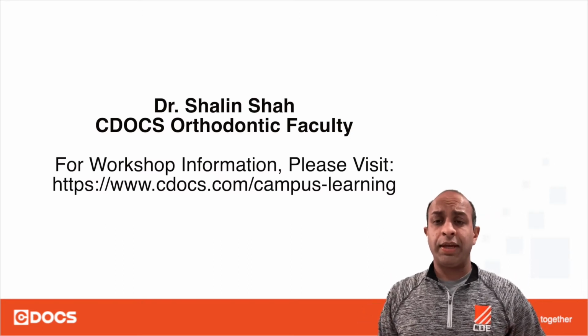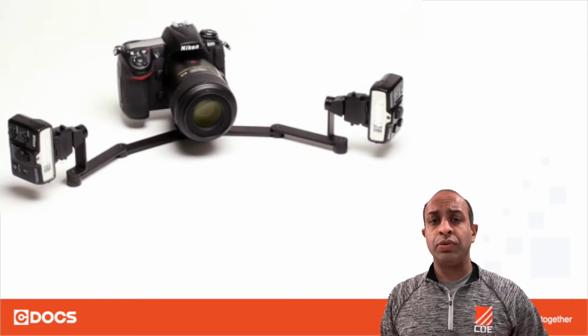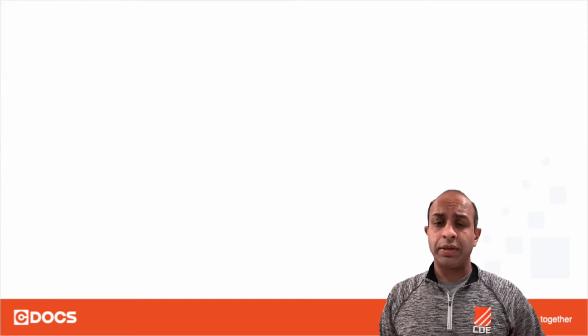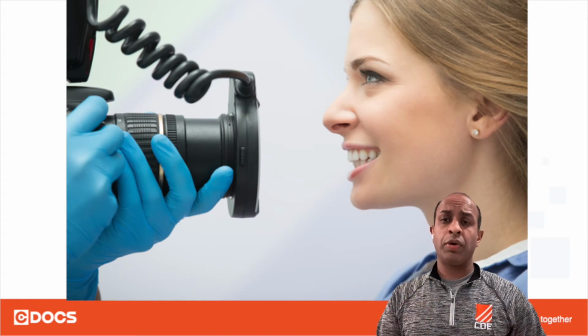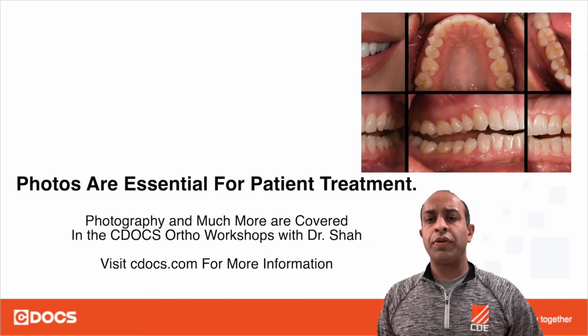Today's tip of the day is photography, and photography as it relates to your clear aligner submissions. It's essential that when you're not only submitting your case for the very first time, but also when you're doing refinements, whether it's mid-course or at the end of your first iteration of aligners, that type of refinement, all of those need photos.